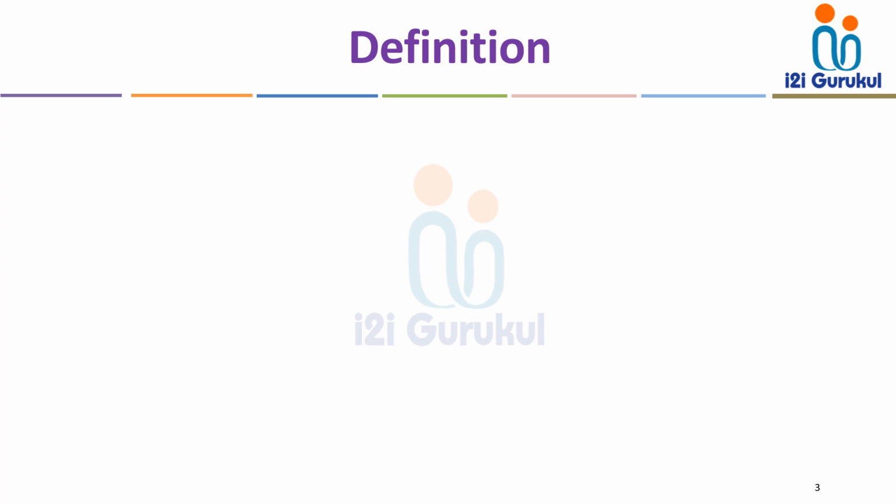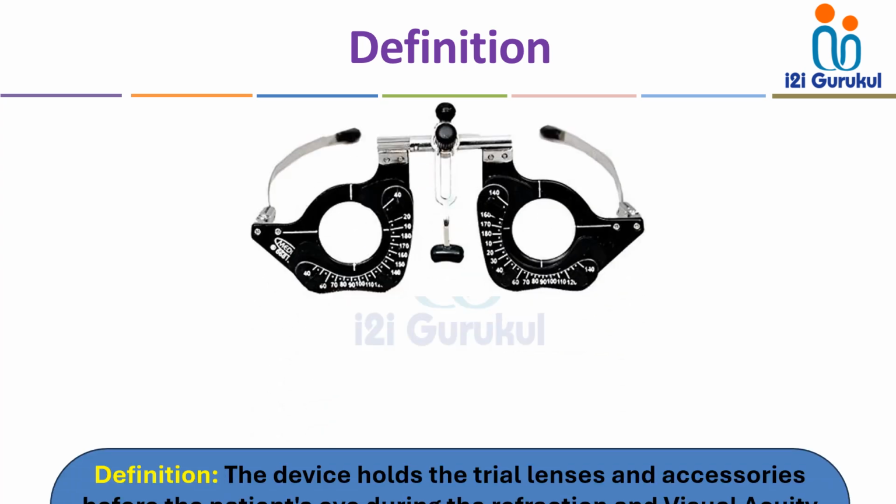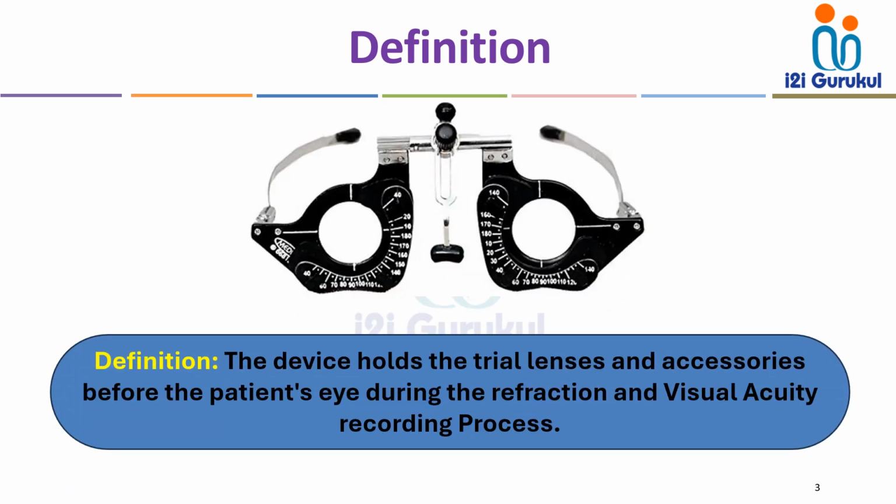Moving towards the definition of the trial frame. Friends, the definition of the trial frame is: the device that holds the trial lenses and accessories before the patient's eye during the refraction and visual acuity recording process.